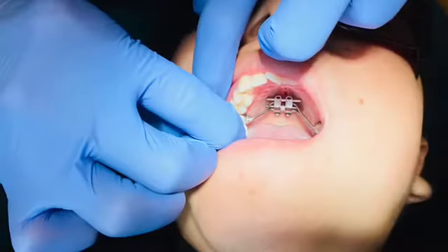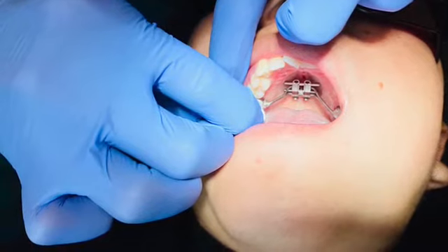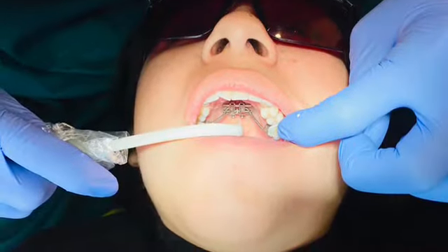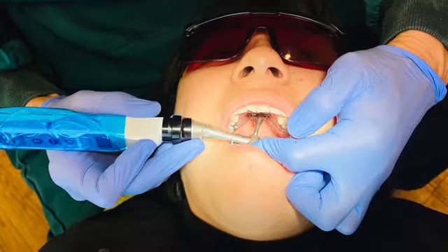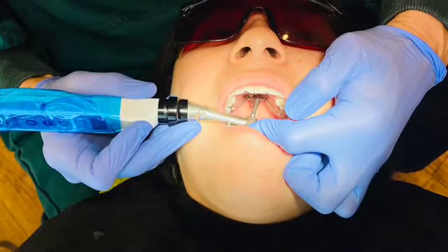Next up is the cementing of the molar bands. Then it's time to place the four TADs, or mini screws, into the MSE expander, followed by some hand tightening by Dr. Ting.